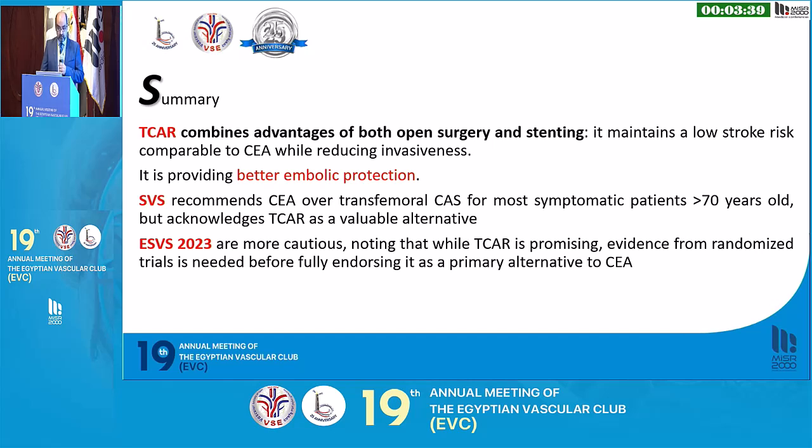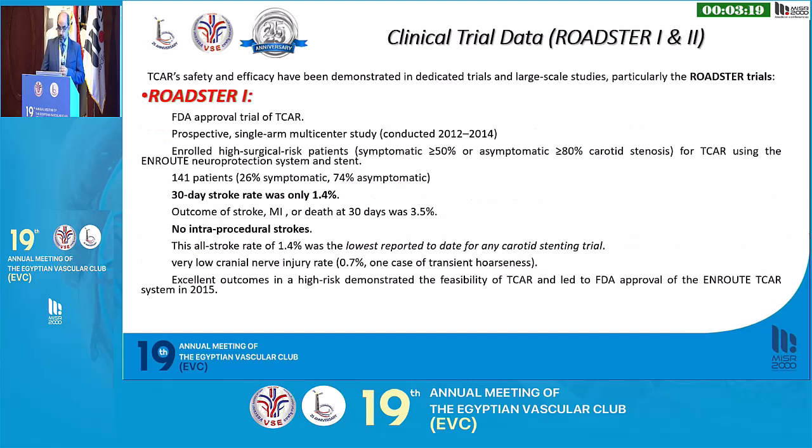And finally, we found that the TCAR is a valuable alternative to the usual transfemoral carotid artery stenting. About the ESVS in 2023, they are more cautious, noting that while TCAR is promising, evidence from randomized trials is needed before fully endorsing it as the primary alternative to carotid endarterectomy.